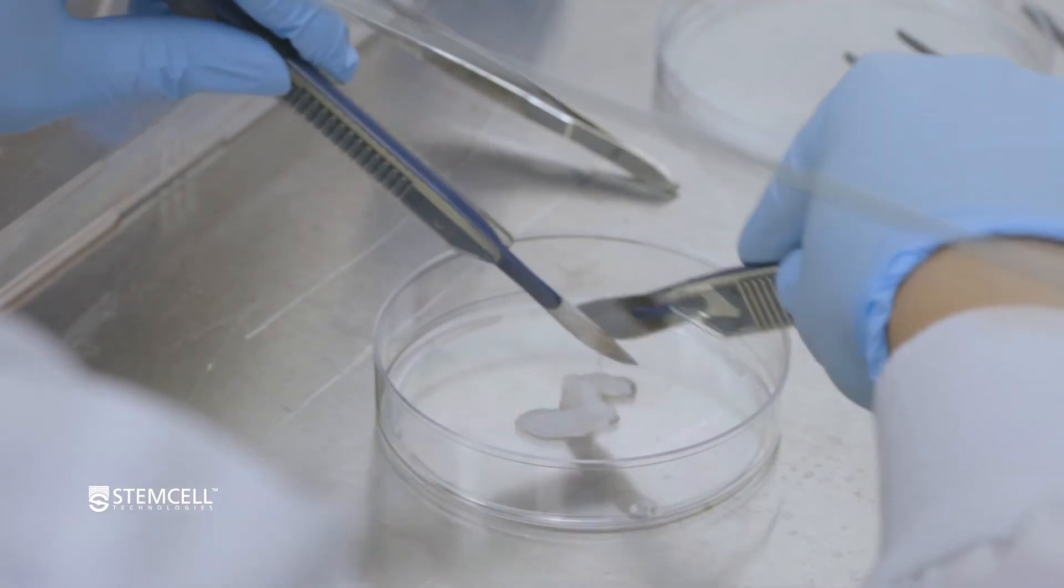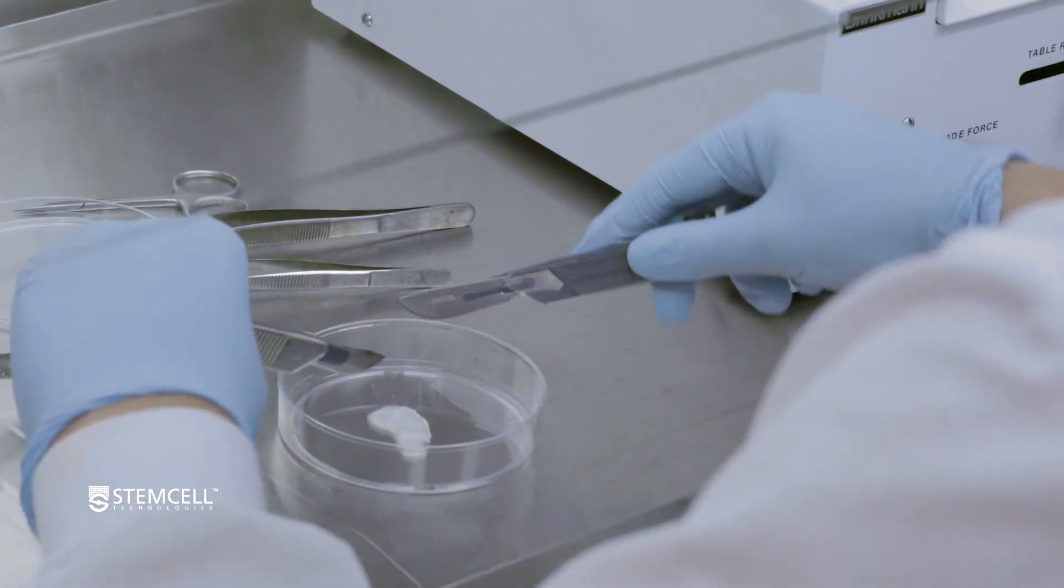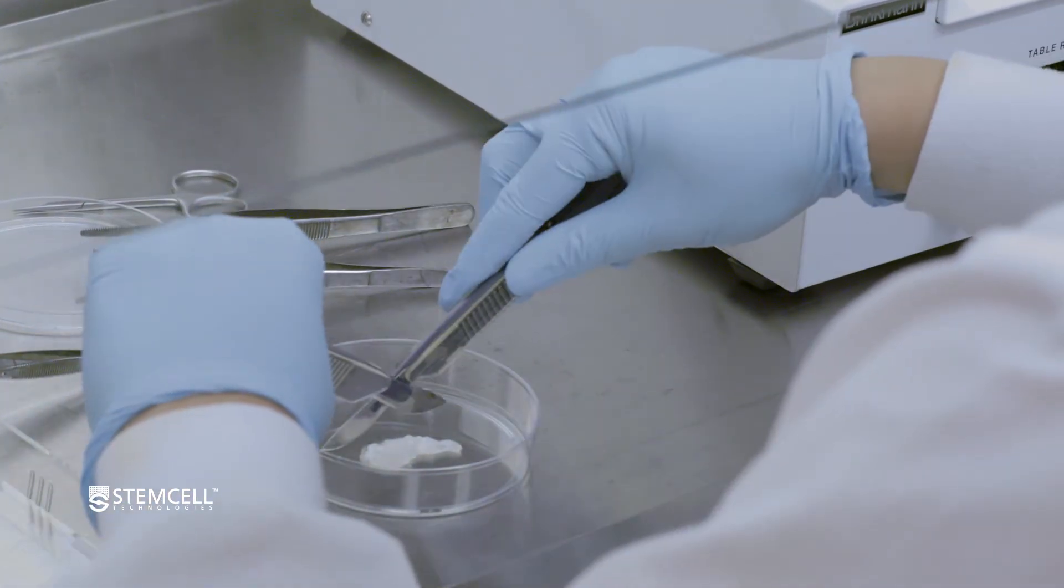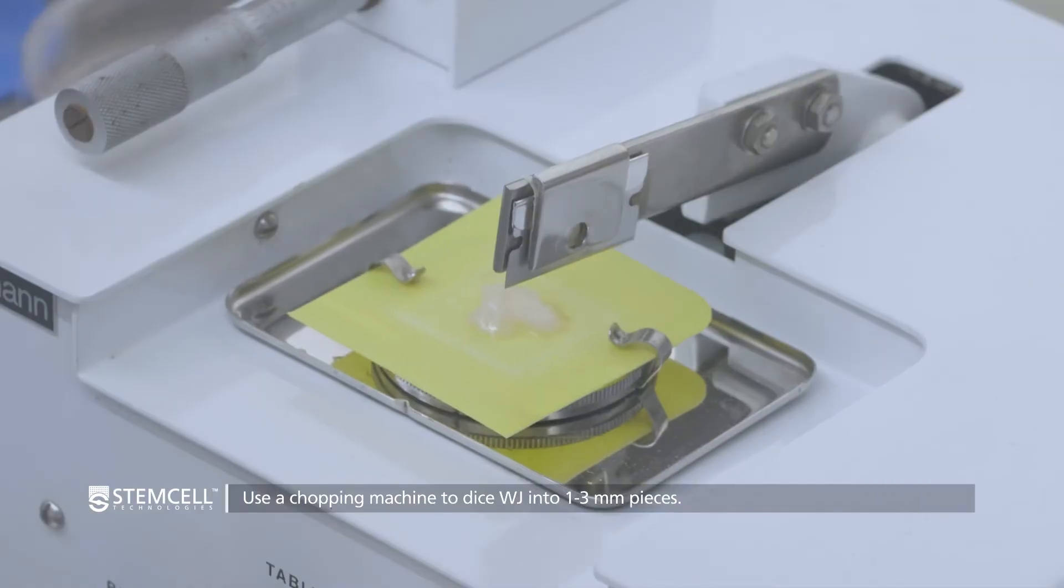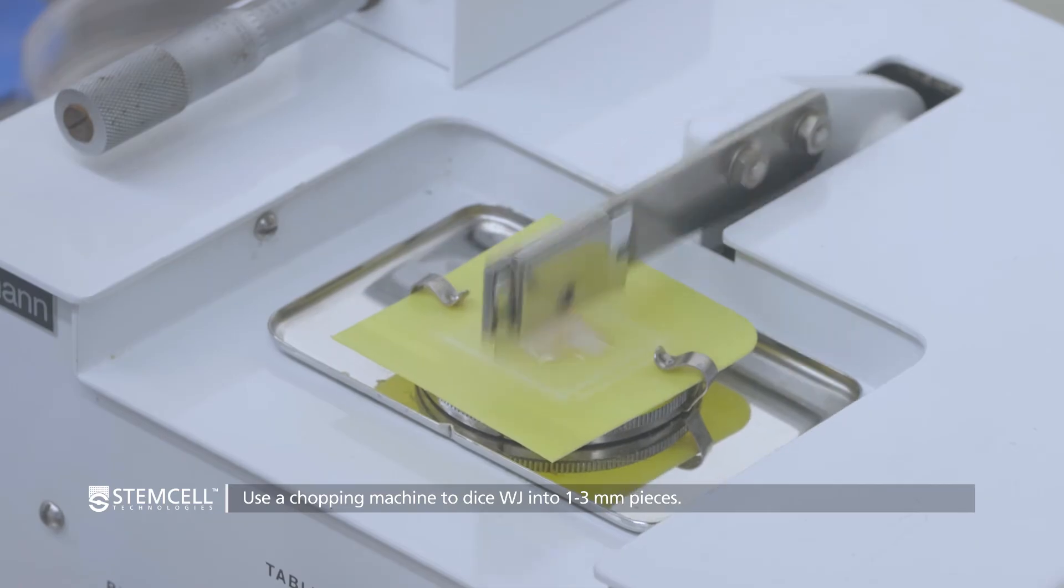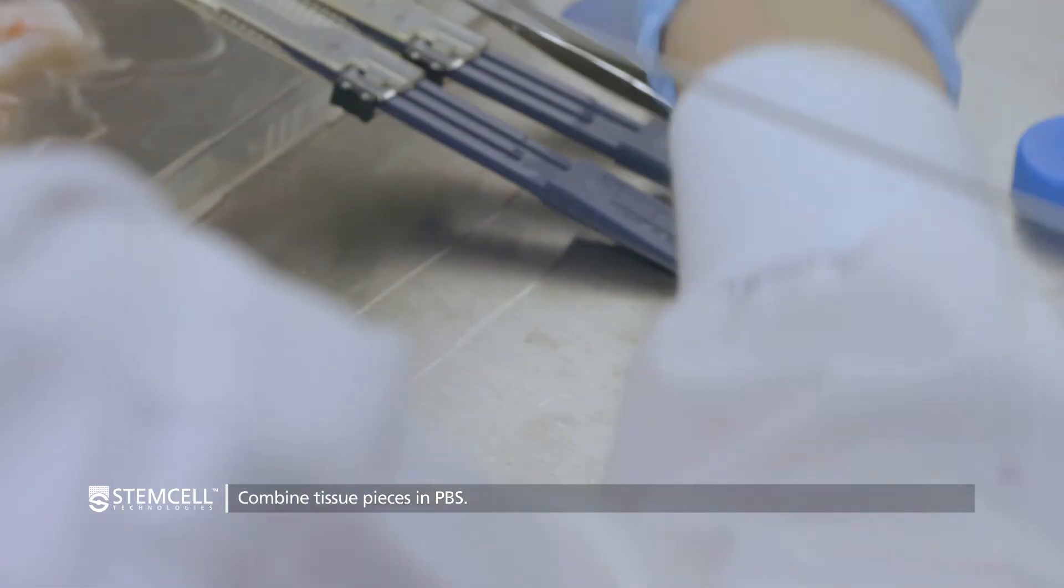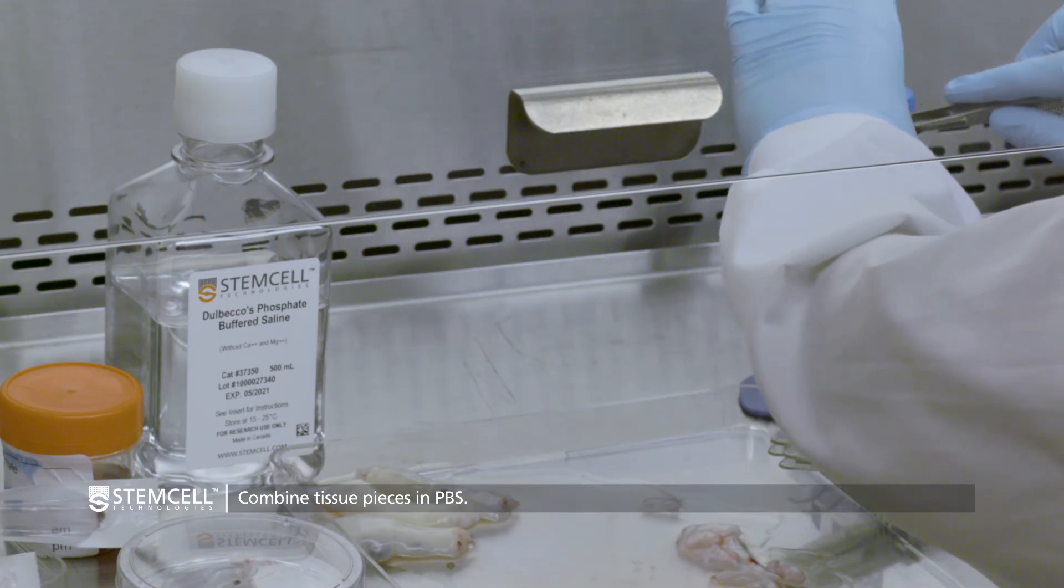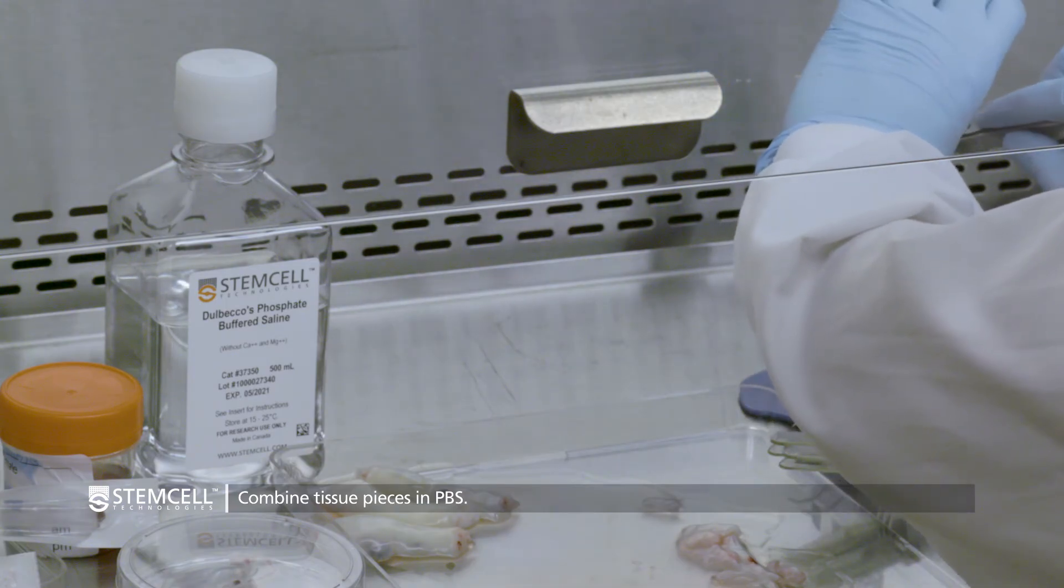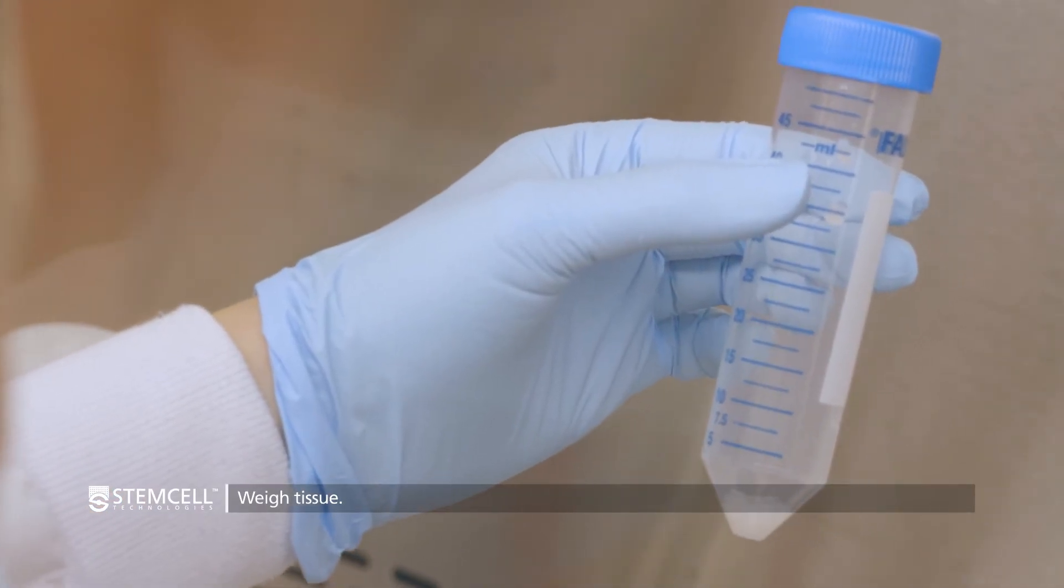Dice perivascular Wharton's jelly into approximately one to three millimeters squared pieces. This can be done using a scalpel, scissors, or a tissue chopping machine, such as a McIlwain tissue chopper. Keep tissue pieces hydrated in PBS. Combine all tissue pieces into a 50 ml falcon tube in a minimum volume of PBS and record the total weight.